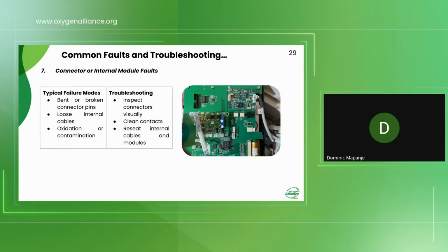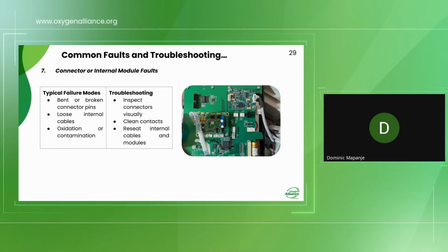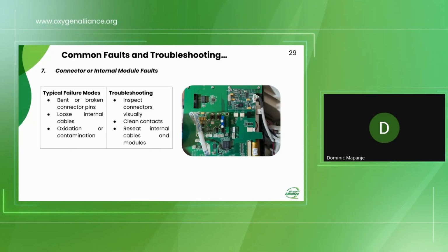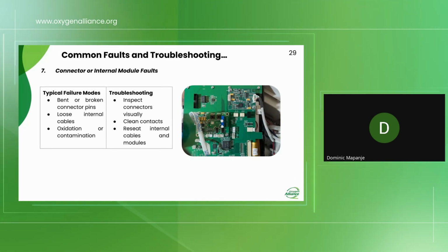You can verify this by seeing intermittent parameter readings and seeing that the accessories are not being detected. So to troubleshoot this, you inspect the connectors.